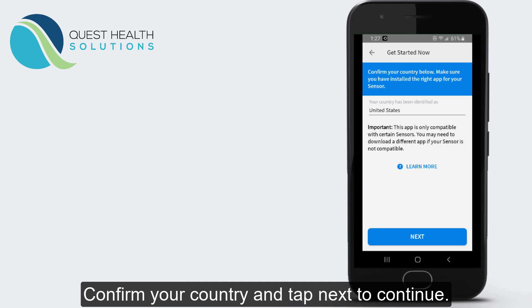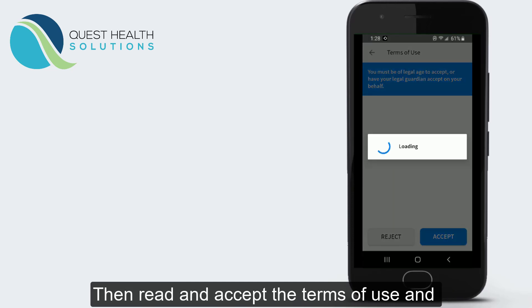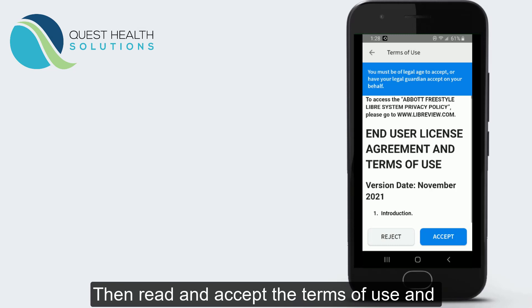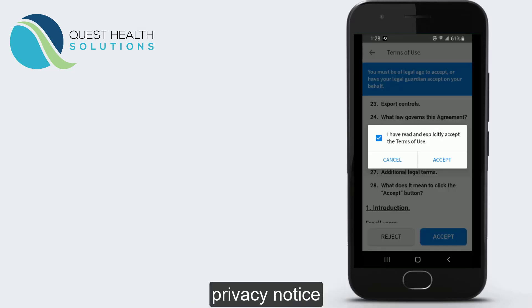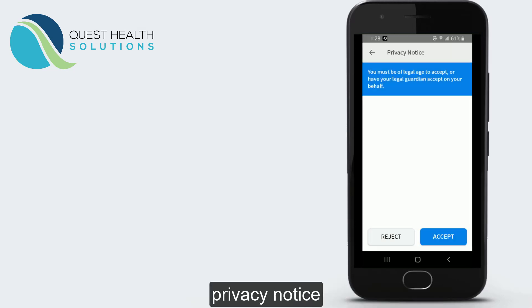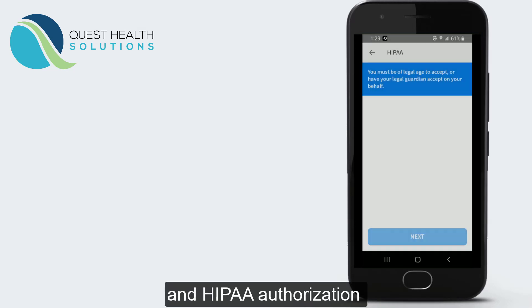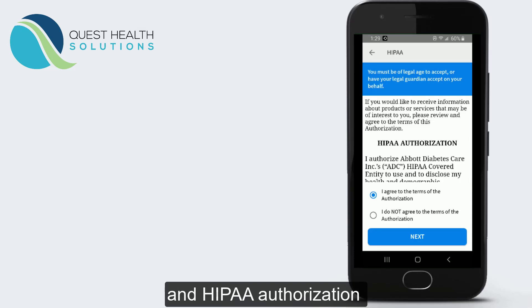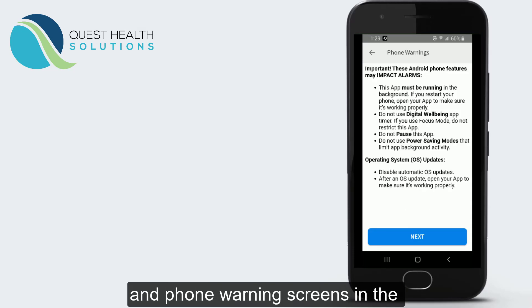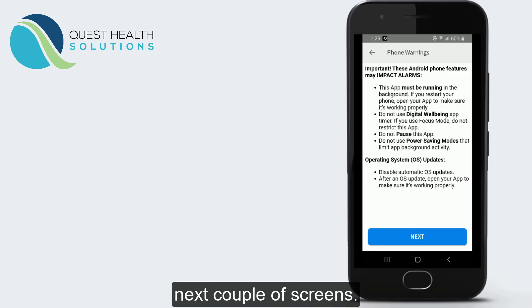Then confirm your country and tap Next to continue. Read and accept the Terms of Use and Privacy Notice and HIPAA Authorization and Phone Warning screens in the next couple of screens.